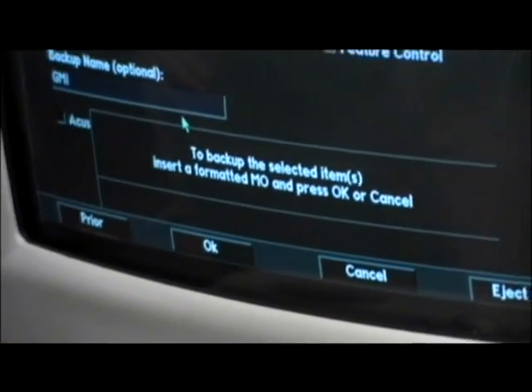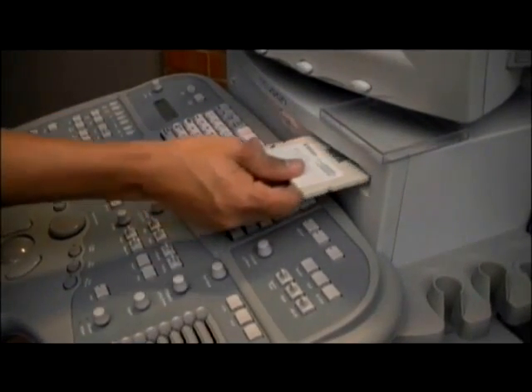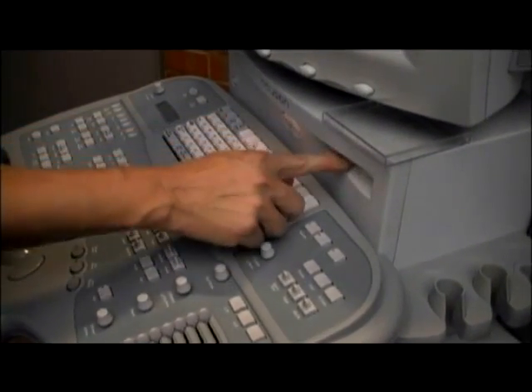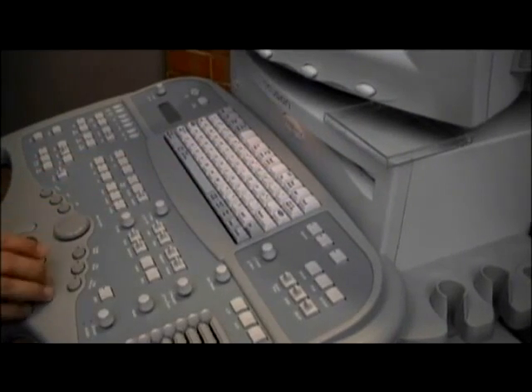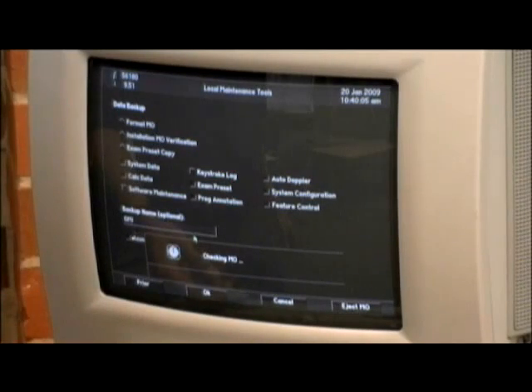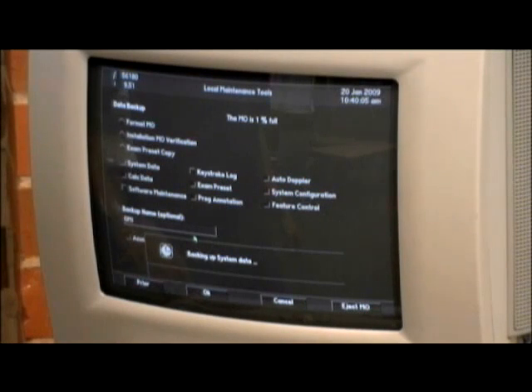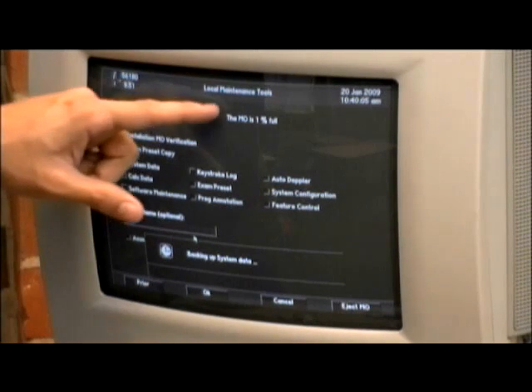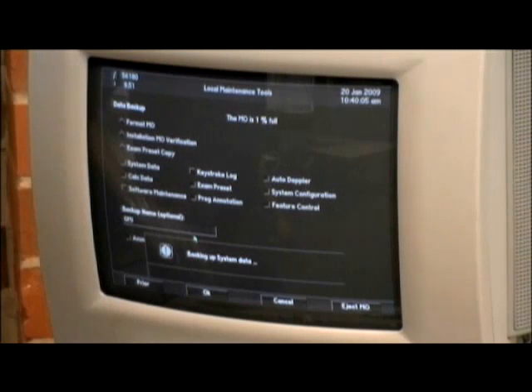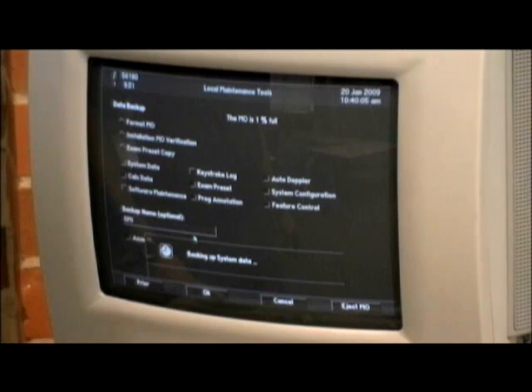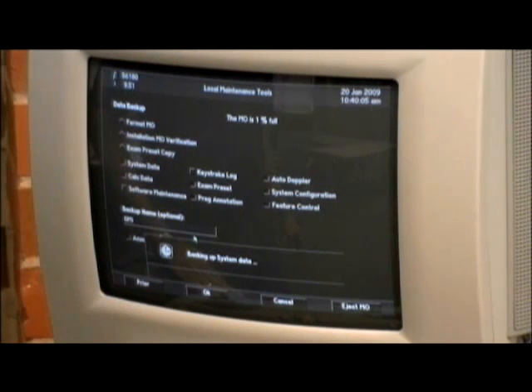You will be prompted to insert a formatted MO disk. Insert the backup MO disk that was removed from the front pocket at the beginning of this process. Your system will check the MO and will begin backing up the 7 files which were previously selected. At the top of the screen there will be a percentage indicator informing you of how much of the backup is complete. Whichever file it is currently backing up will be displayed in the box at the bottom of your screen.